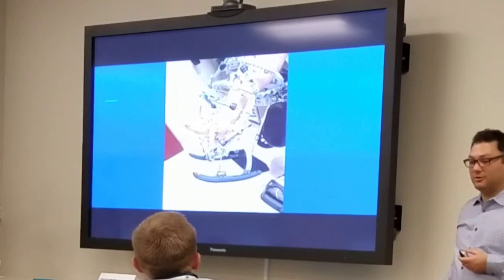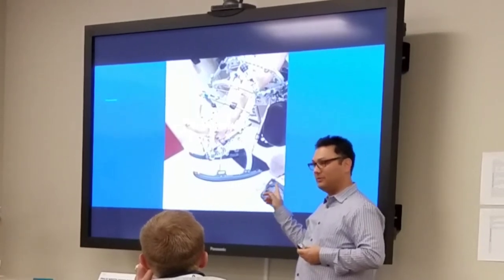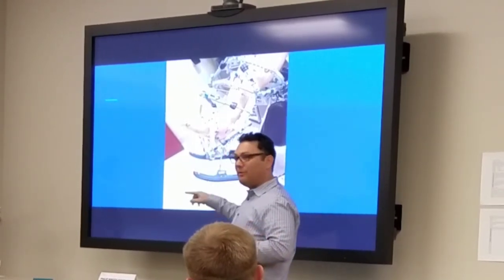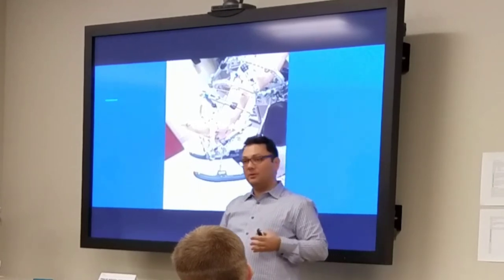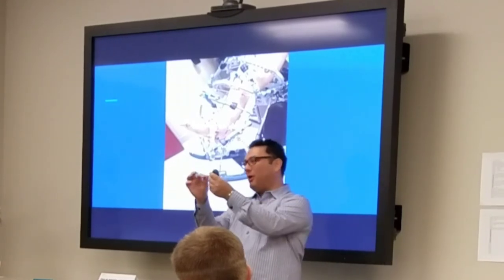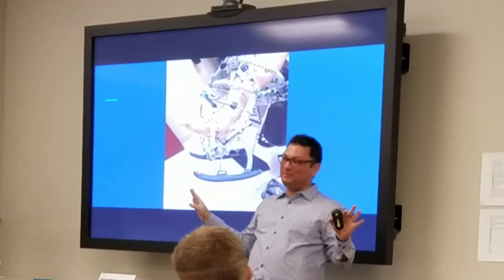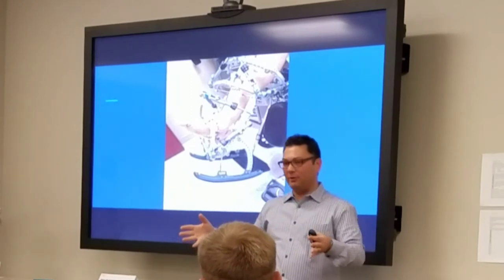Now this is actually not super stable, but what you can do to make it stabler is take two walking plates and attach them to each other. If you have any walking plates, you could just take two and make four walking plates altogether. Extremely sales rep friendly. If you take the two walking plates and put a threaded rod through them, it gives you a much better support.